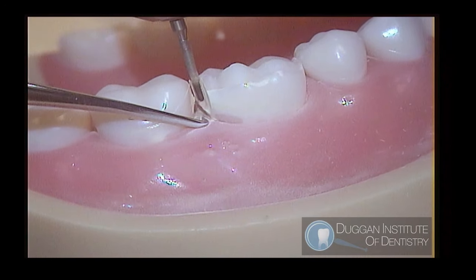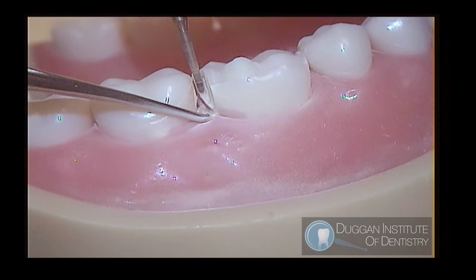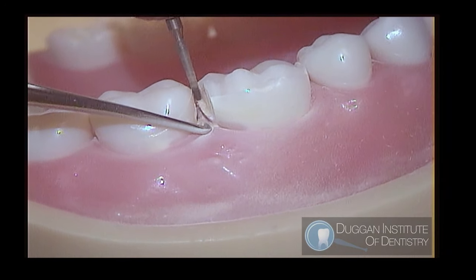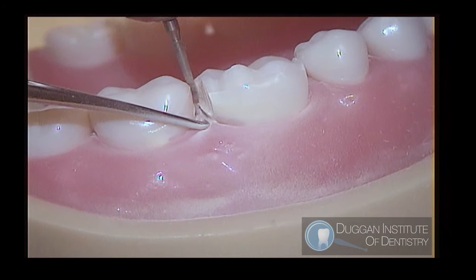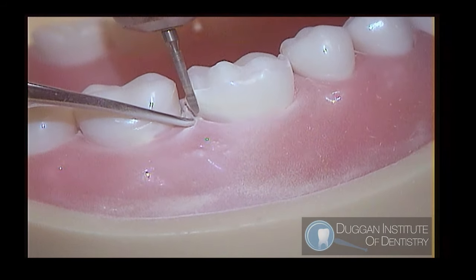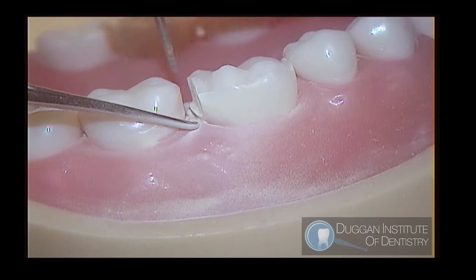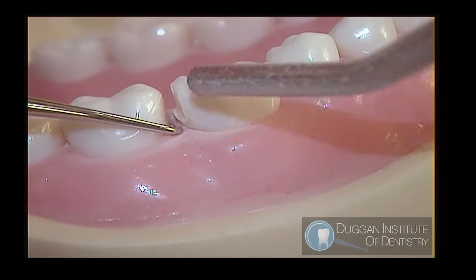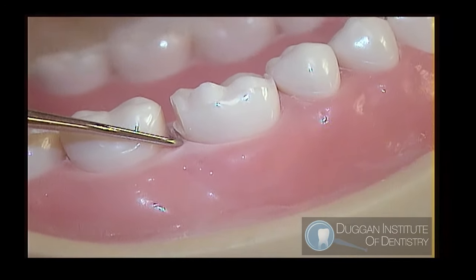For this step, I'm using a thin chamfer burr, the 6878K 012 diamond. We want to start with our gingival margin a little more than 1/2 mm above the gingiva. Position the burr to be parallel to the adjacent tooth. Cut using the whole diameter of the burr. Cut straight back to the lingual. Keep the gingival margin up. Create a 1/2 mm chamfer.